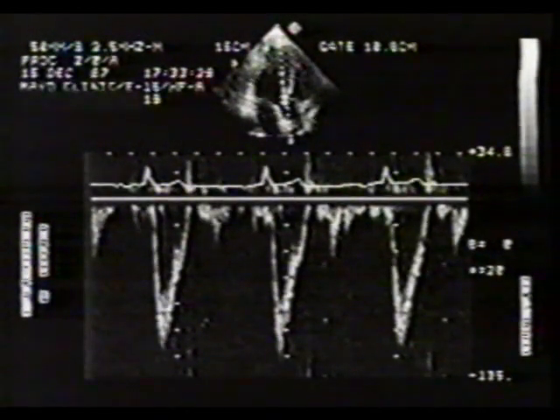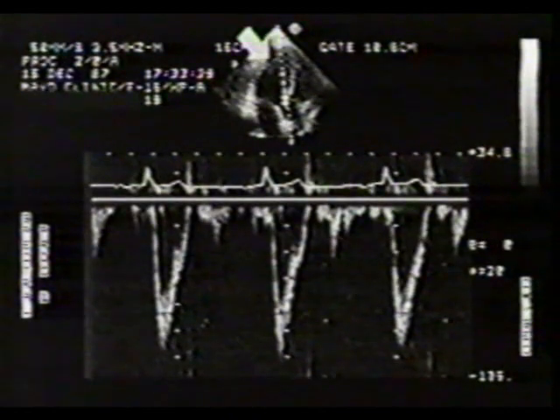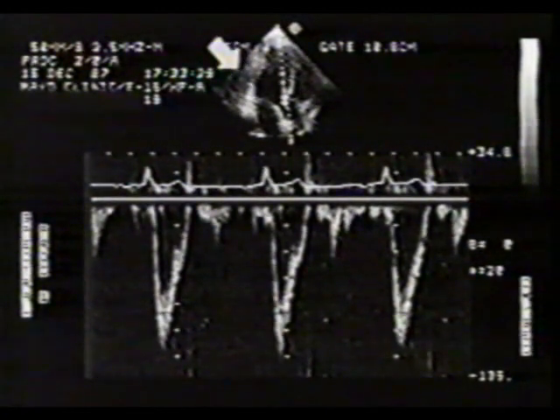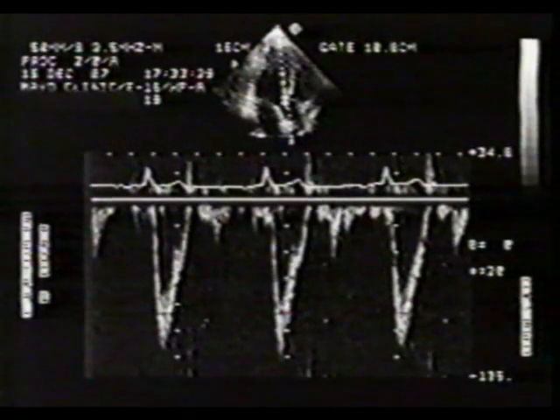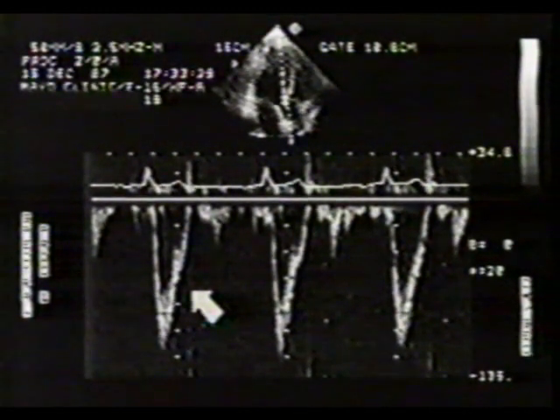The transducer has now been rotated and tilted anteriorly to develop the apical long axis view. The sample volume has been placed in the left ventricular outflow tract. The small 2D image is again used to document the sample volume position. Since flow through the left ventricular outflow tract is away from the transducer, the systolic velocity spectrum is recorded below the baseline.